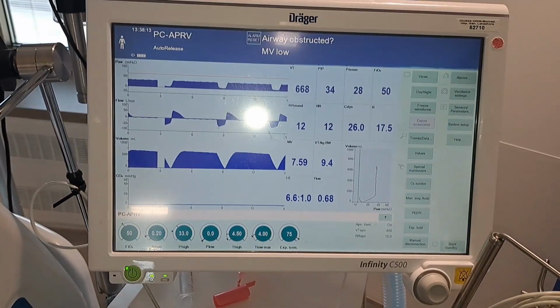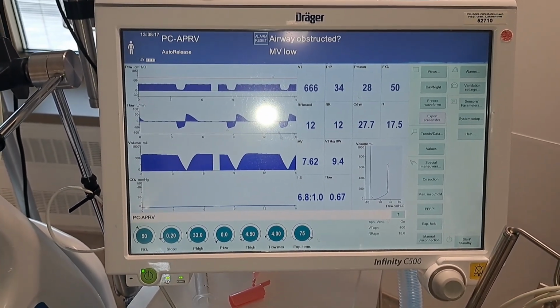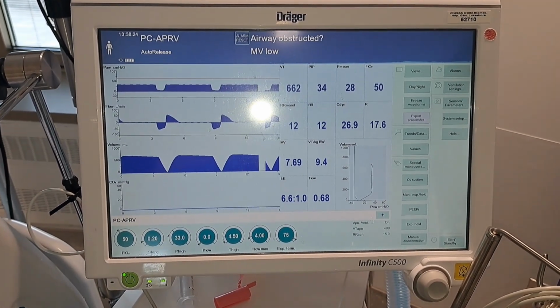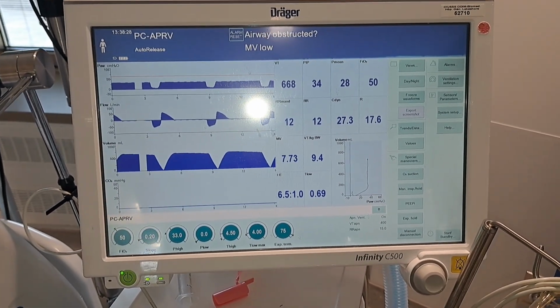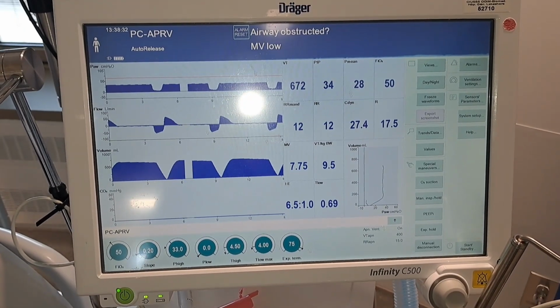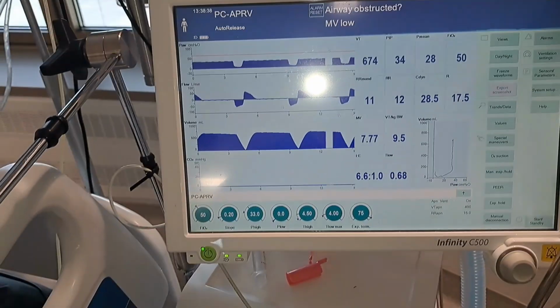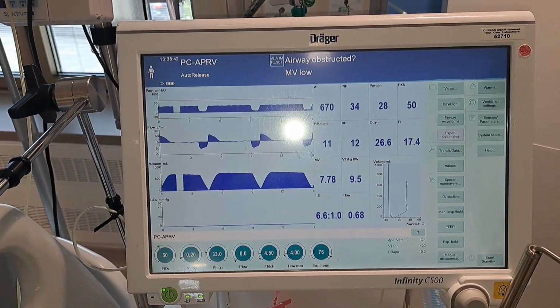It's not always about a certain pressure exerted. The pressure has to be exerted, obviously, right? But sometimes it's not a question of more pressure to open the lung. It's a question of that pressure being exerted for a longer time. As we know, time constants, right? If we remember looking at time constants, because the lung in general, especially when we have a patient that's intubated, there's going to be varying time constants.